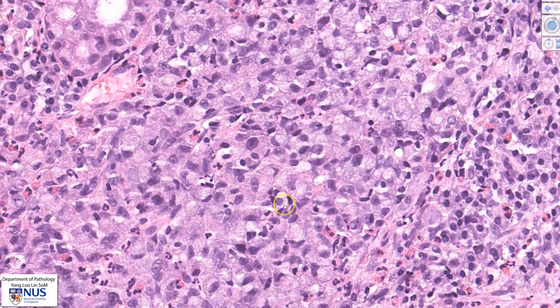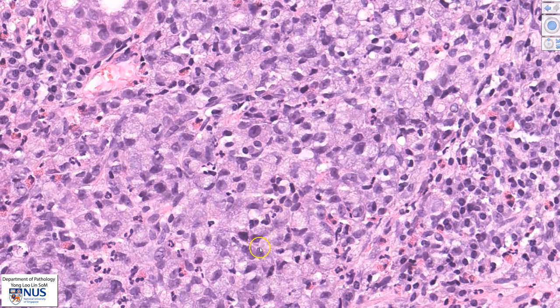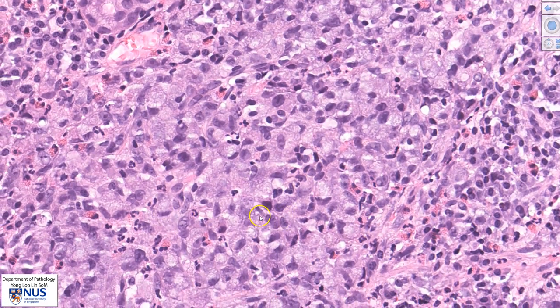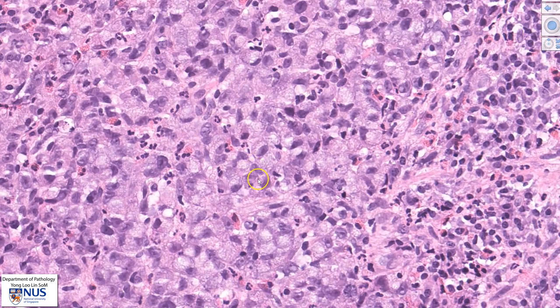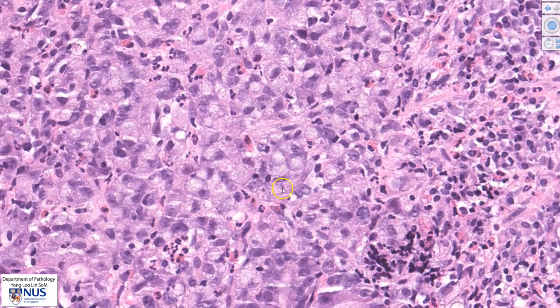The grayish, bubbly cytoplasm is because it is full of mucins. Looking around, we can see some other cells with a similar eccentric, indented nucleus, and again there are a couple of cells here with this shape and appearance.